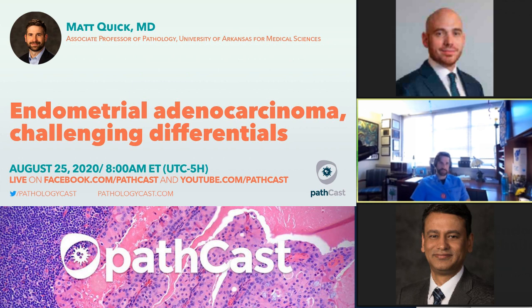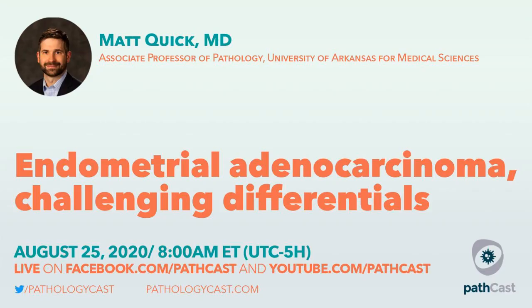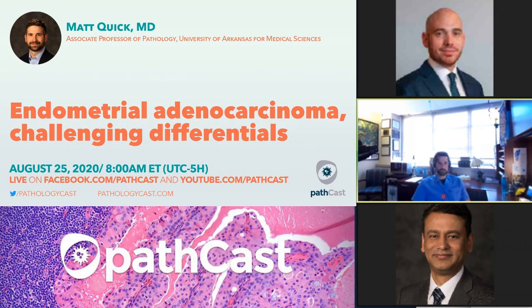Now, that being said, that's just a mutation that has been described in a good number of these tumors. I haven't used INI1 diagnostically for this carcinoma yet. I haven't had to. I think if you have a wide enough staining panel and you confidently rule out all of the other sources of tumor that it could be, that you don't necessarily need it. But if you do have INI1 loss, then you could be looking at an undiff d-diff.